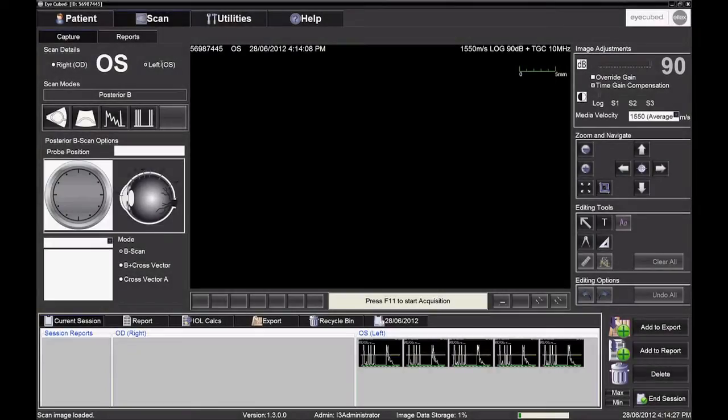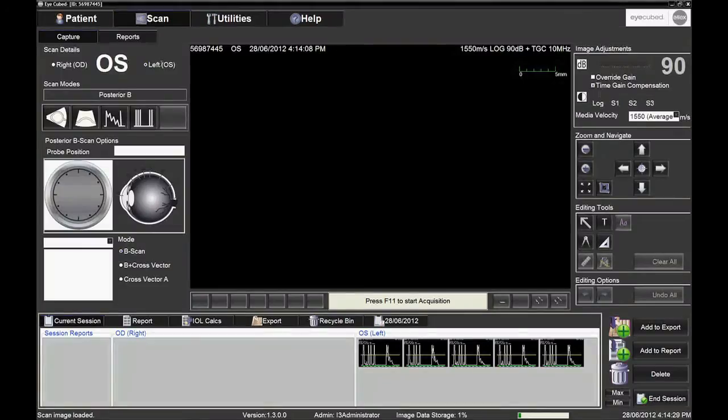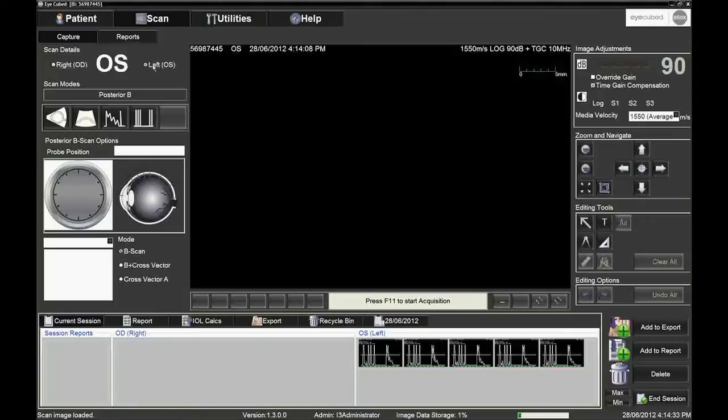You will then prepare the iCubed system to perform biometry by clicking on the appropriate eye to be measured, right eye or left eye, and clicking on the pictogram.